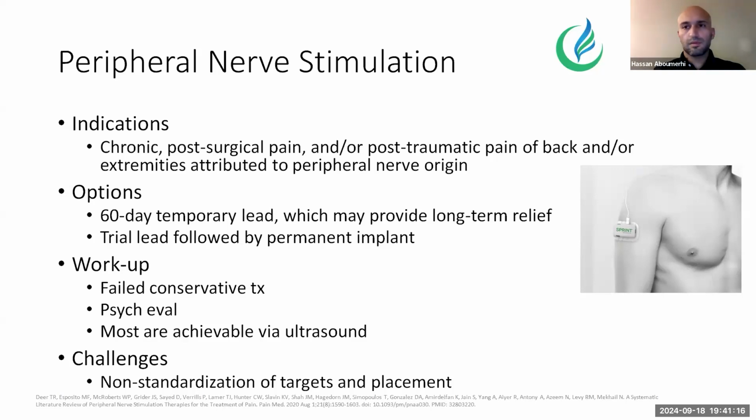And these things can be repeated if necessary. Or there's the alternative where you do a trial first, just like with SCS. And if the patient gets good relief, you can place a permanent one under the skin. And then there's different types of ways to stimulate that wire depending on the device company that you choose.